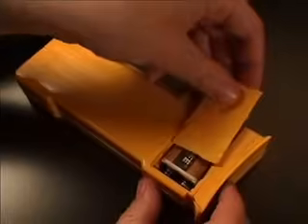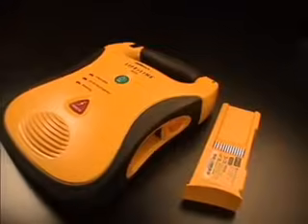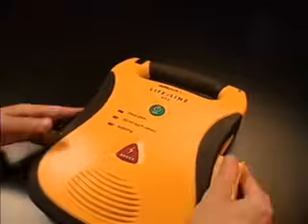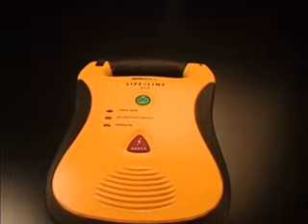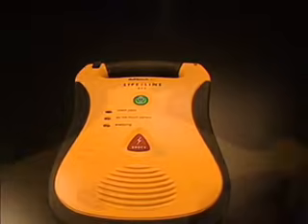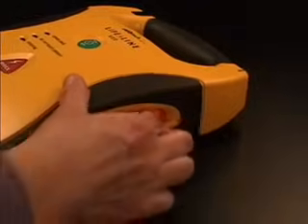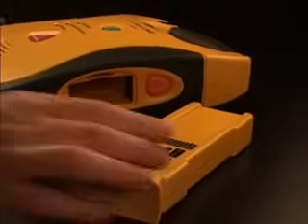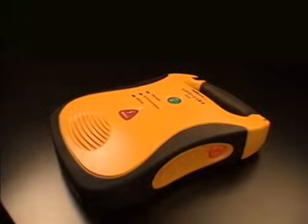If a 9-volt battery is installed in the battery pack, when the battery pack is inserted, the Lifeline AED will automatically run a self-test to confirm that the battery pack is ready to perform a rescue. Remove the battery pack by pressing the battery eject button until the battery pack is partially ejected; it may then be completely removed by pulling it out.